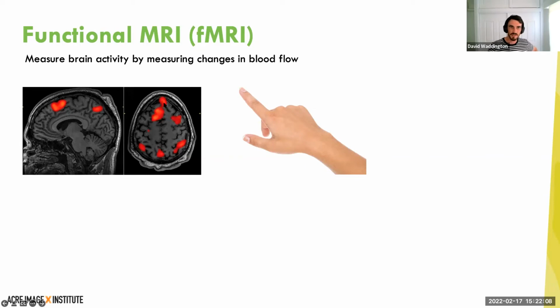And what was discovered, and started being rolled out about 20 years ago now, was the idea that this T2 time we're talking about in your tissues actually gets longer when you use your brain to do something. So what these images depict is that within the brain, the signal is going up in a T2 weighted scan because they told you to think of something.